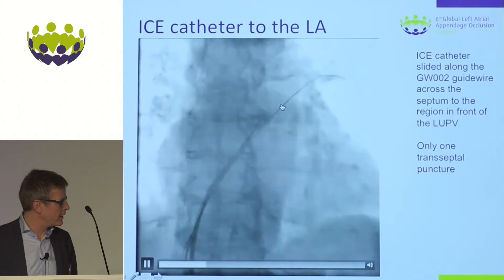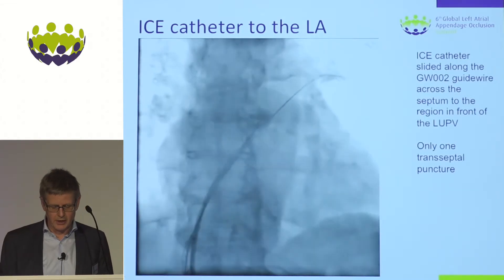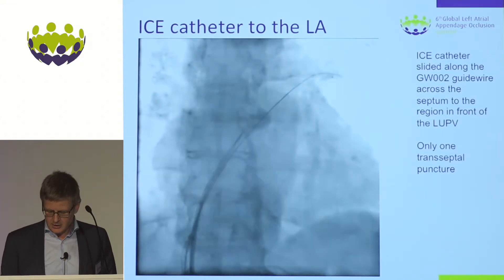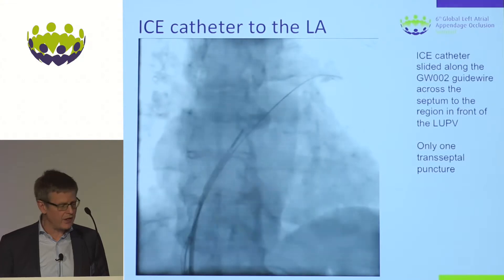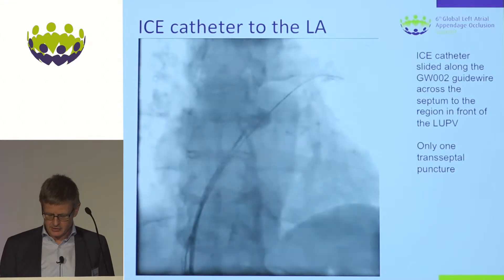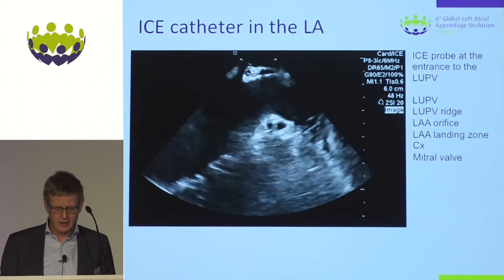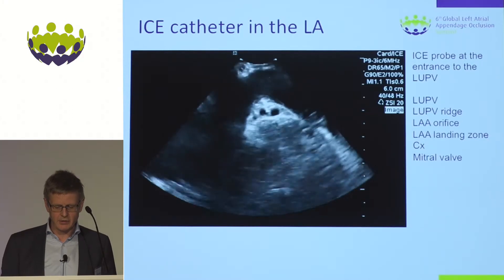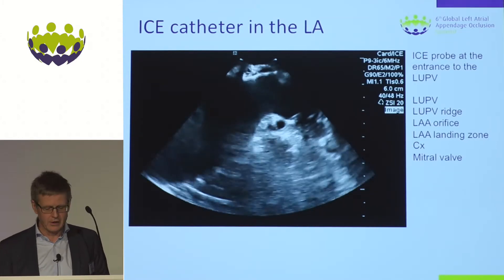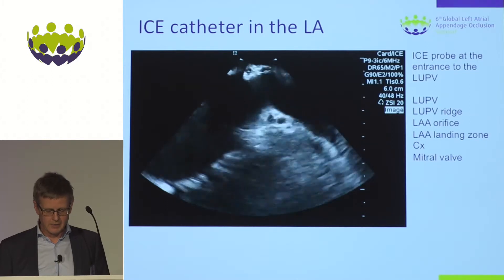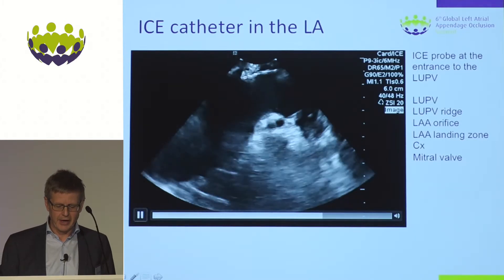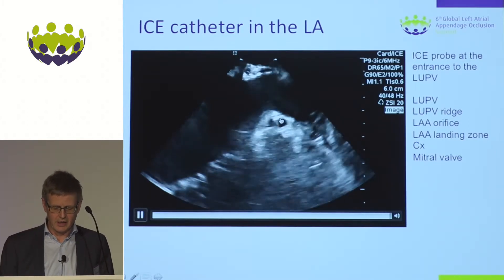A biplane system is helpful but not necessary — with a monoplane system you just rotate to ensure parallelism with the wire. Advance the tip of the ICE probe to the region just outside the left upper pulmonary vein, and you obtain nice images of the left atrial appendage that closely resemble what you see in fluoroscopy and in the 45-degree TEE view. You can clearly identify all anatomical markers: the left upper pulmonary vein ridge, the orifice, and the circumflex artery.